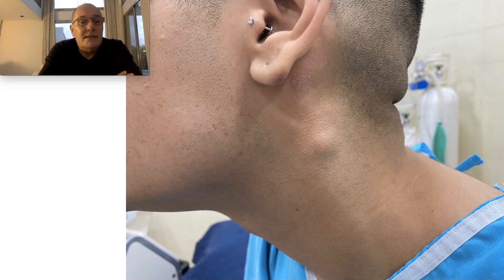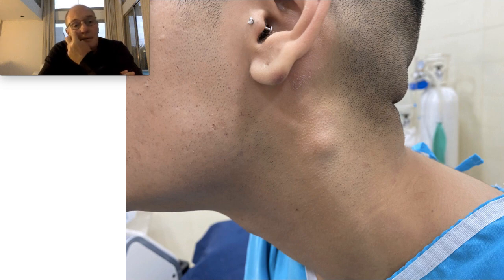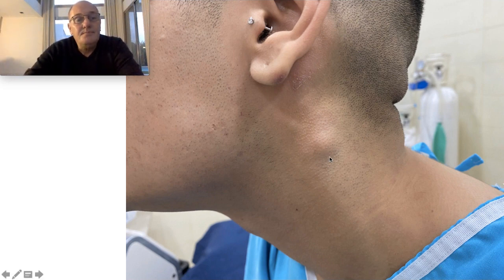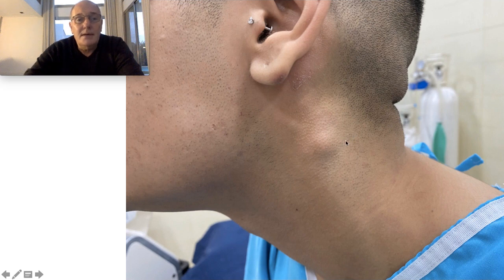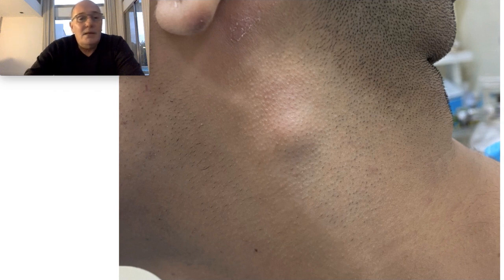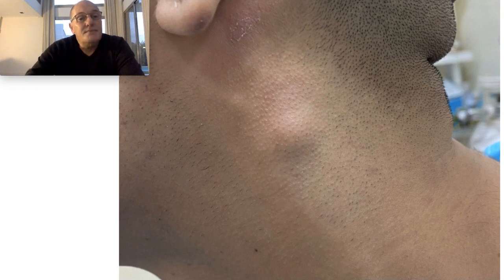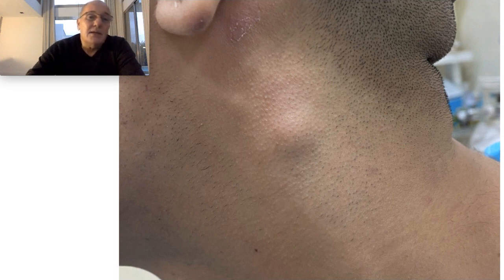This technique is for removing a cyst or other skin lesion using laser technology. This patient came from the countryside and has an important cyst. He went to many surgeons and all proposed leaving a big scar. I have nearly 2,000 educational videos and nearly 400 followers.